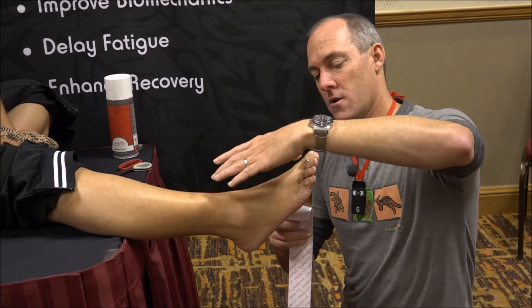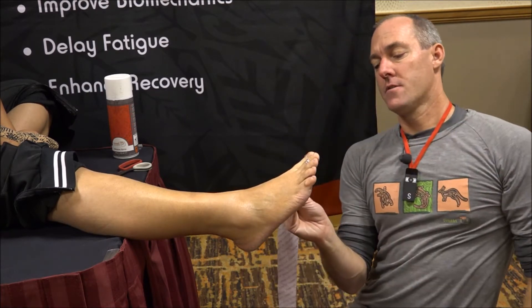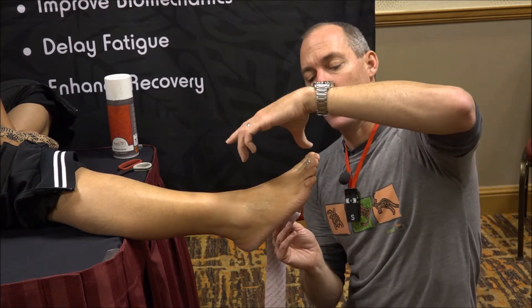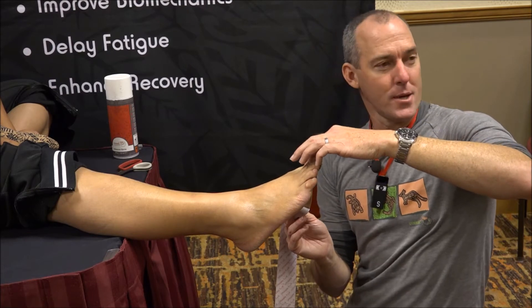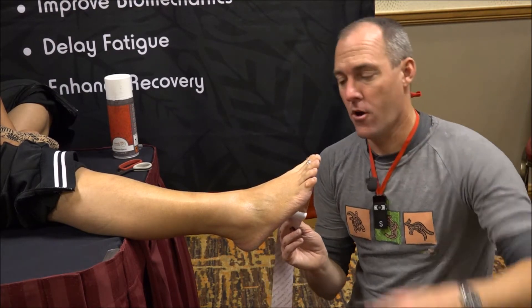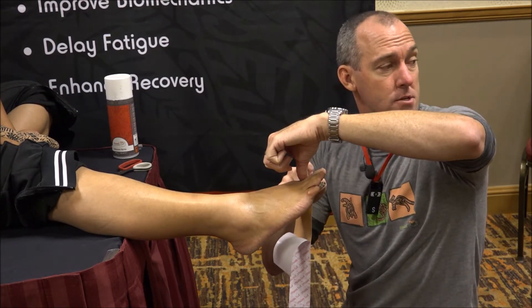I usually do it from that side, but because we have the camera, I'm going to try and do it from here. Peel a bit of your backing paper off — enough to get you to your heel. Don't push on the end of the toe, because that's going to give you a lot of IP flexion, which is then going to be uncomfortable. So push on your proximal phalanx so you get MTP flexion without IP flexion.